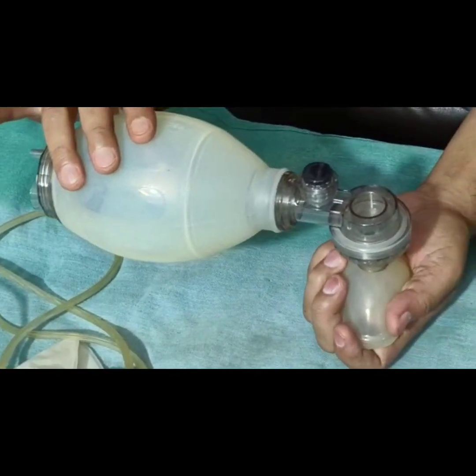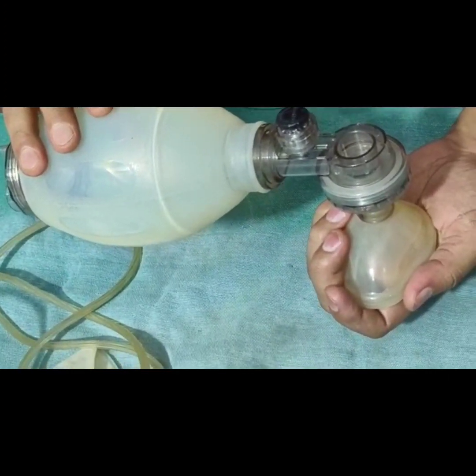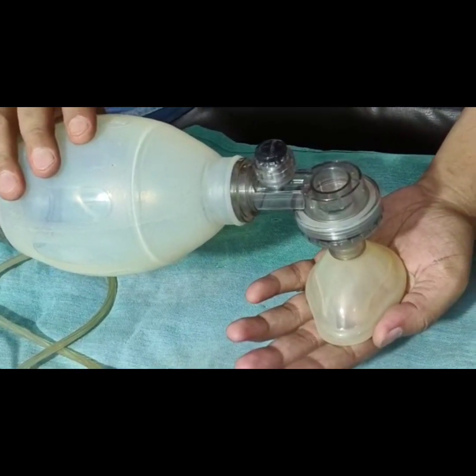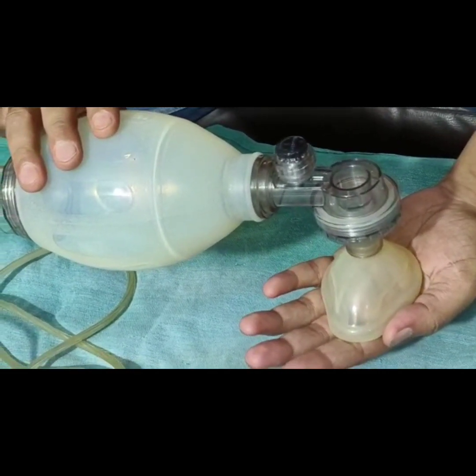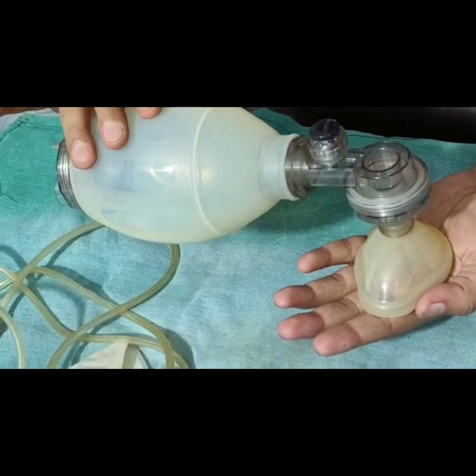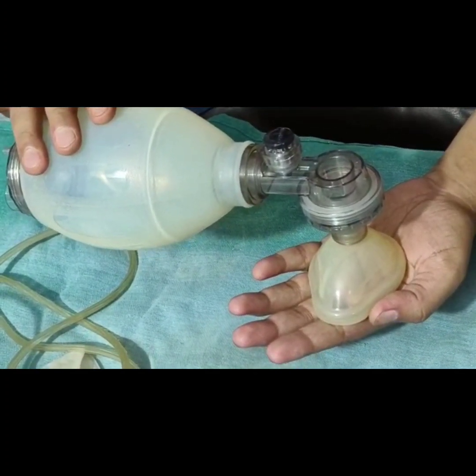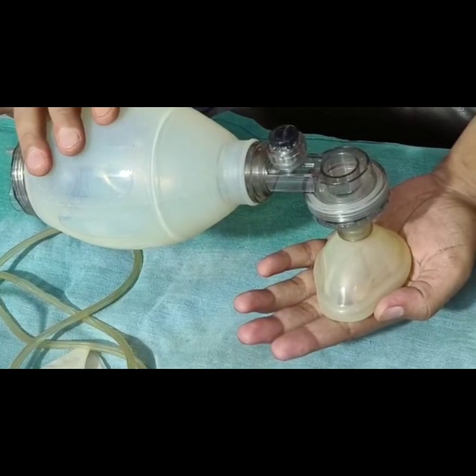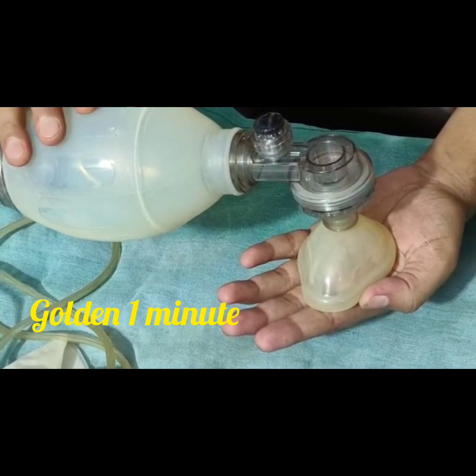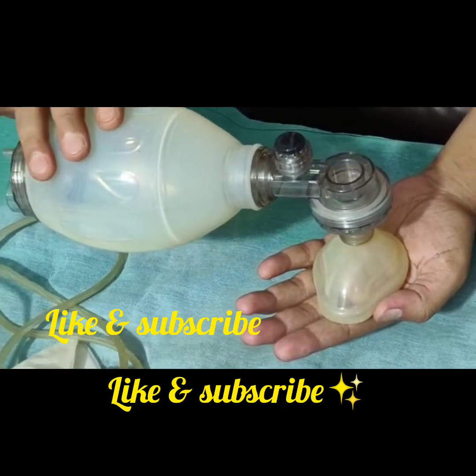This is the most important instrument which should be present in all delivery rooms. Staff should be trained properly for the usage of this self-inflating bag so that babies can be resuscitated at the golden one minute. With this, I end this video. Thanks a lot.